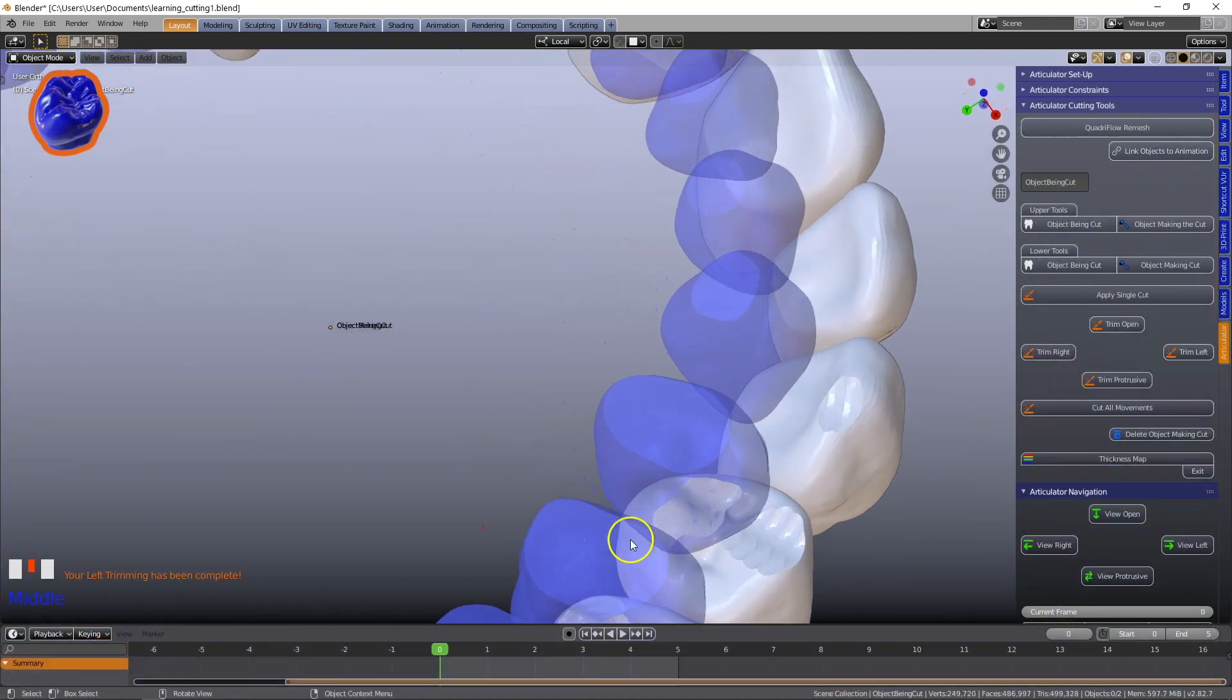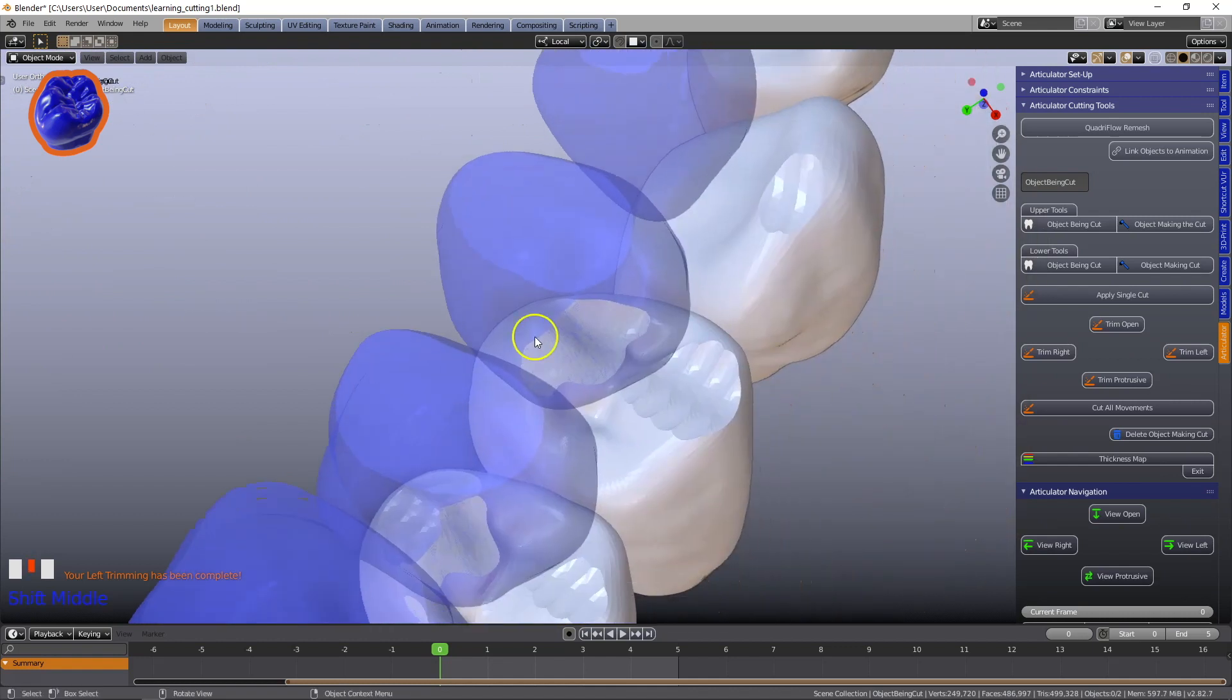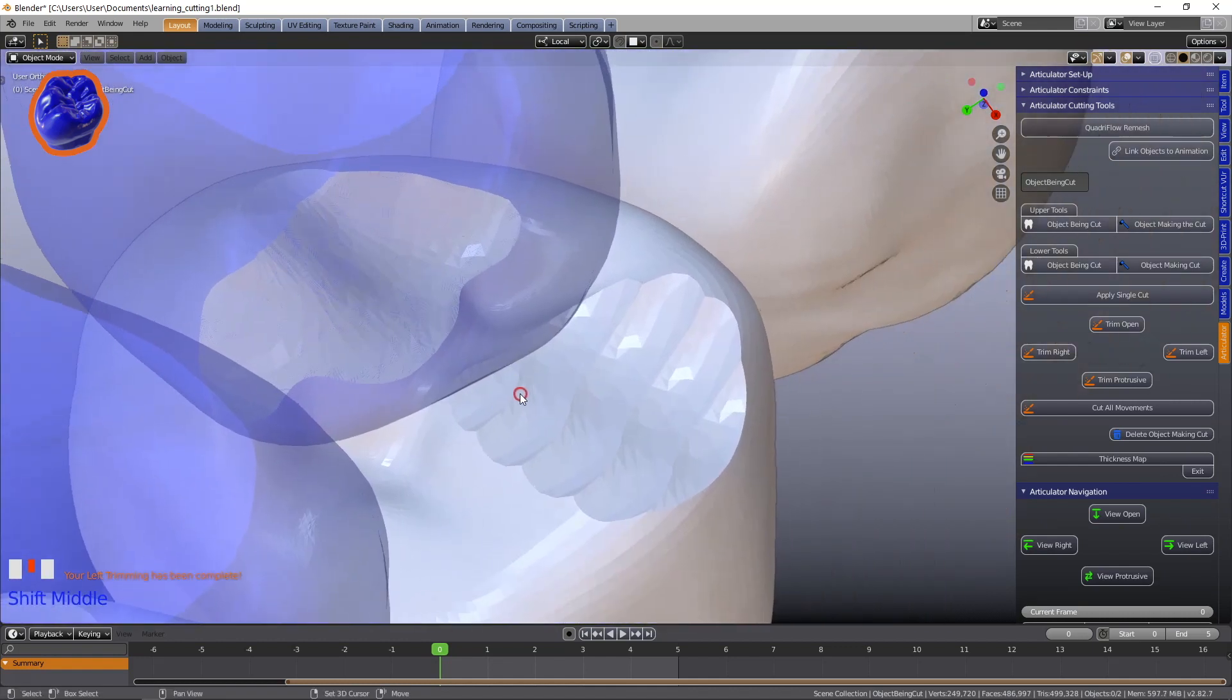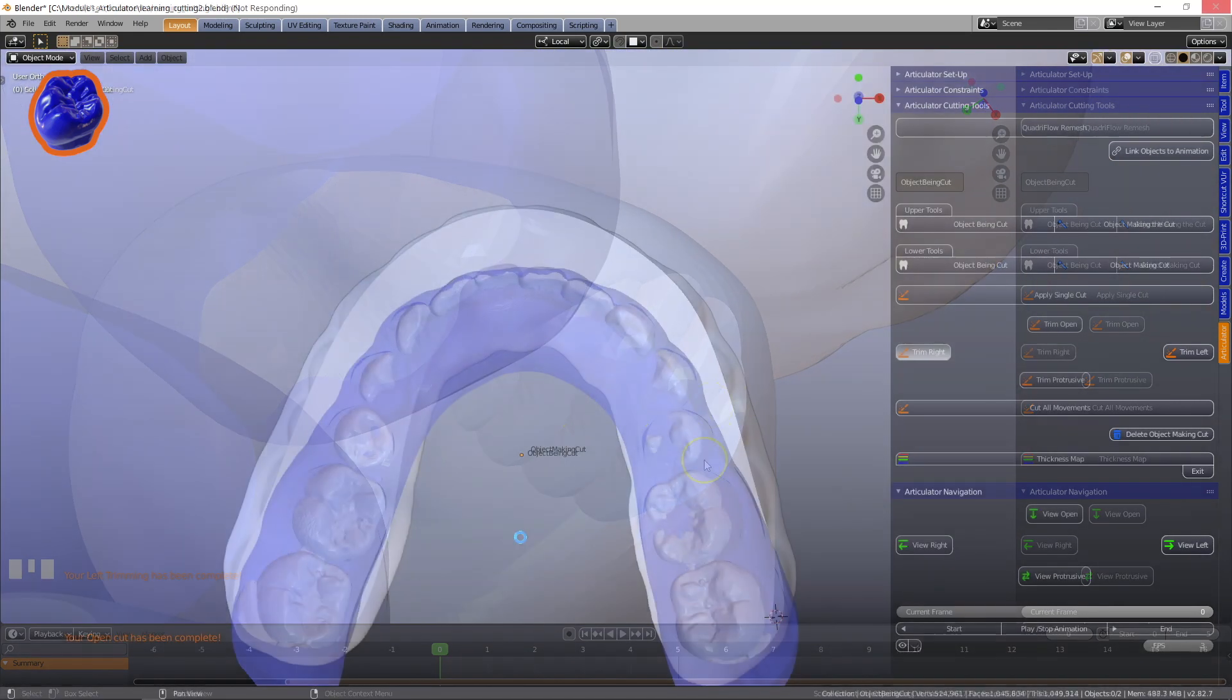Dynamic cutting tools will create large surface adjustments in lateral and protrusive excursions.